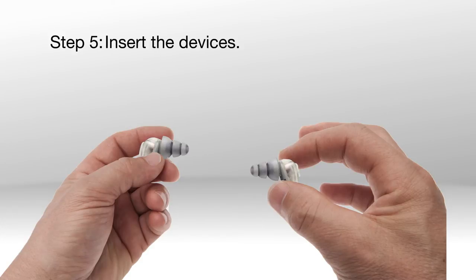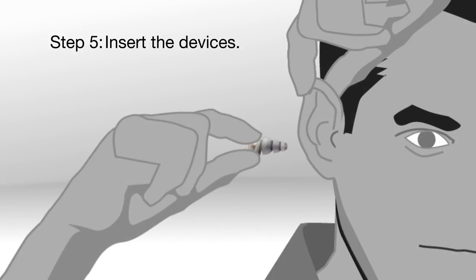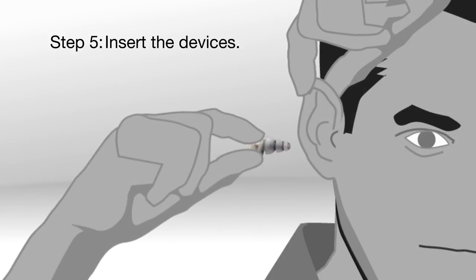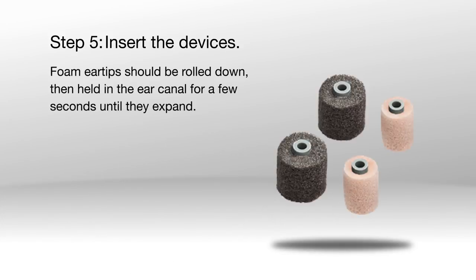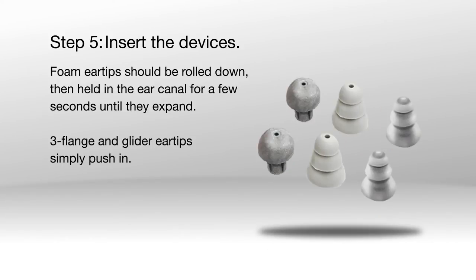Step 5: Insert the devices. Insert a device by pulling up and back on the ear, then twist and push gently until the ear tip seals in the ear canal. Foam ear tips should be rolled down, then held in the ear canal for a few seconds until they expand. Three flange and glider ear tips simply push in.